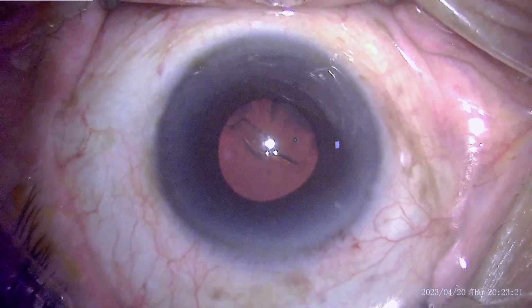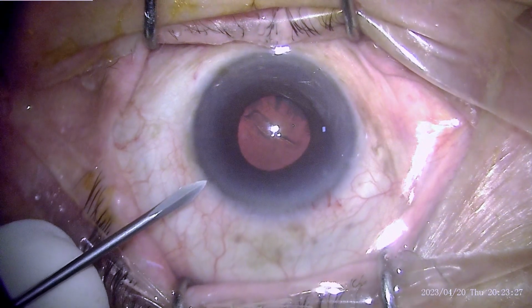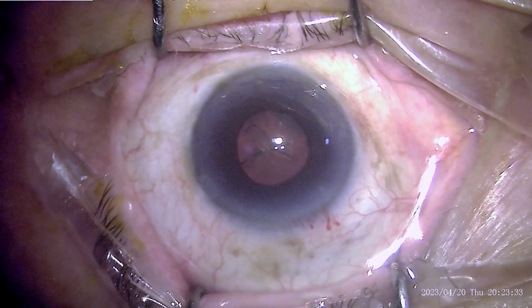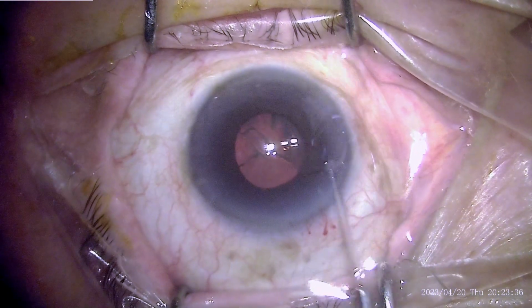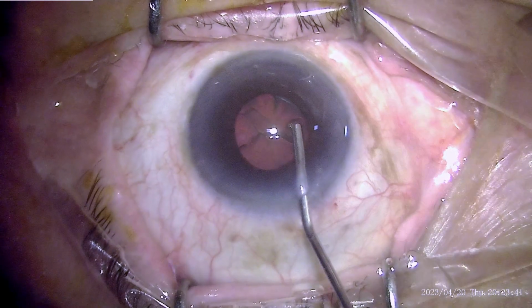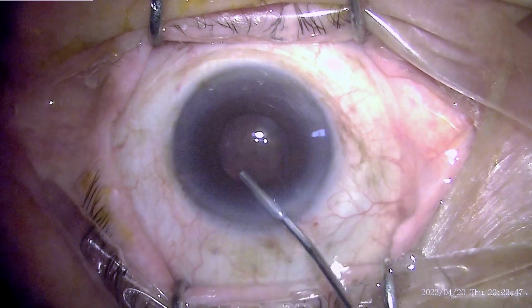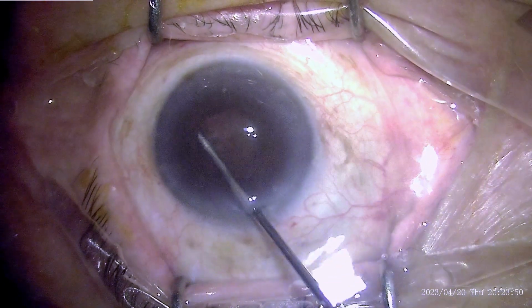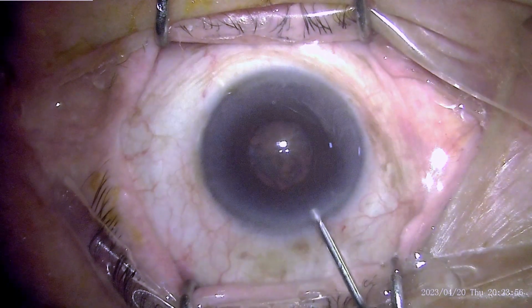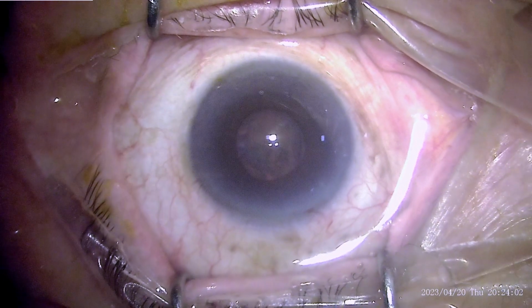We can see it has been done. Once the capsulorhexis has been done, one has to make a side port, and this side port knife will invariably hit the iris when it enters, because the iris is in the way and the pupil is not dilated. However, when the pupil is dilated, this is not the situation. Hydrodissection is again a purely blind procedure, but one can touch onto the cortical matter and inject the fluid, being sure that it is deep into the cortex and not above the nucleus, above the capsule. We can see the pupil has constricted slightly, which is not going to be very good for us.